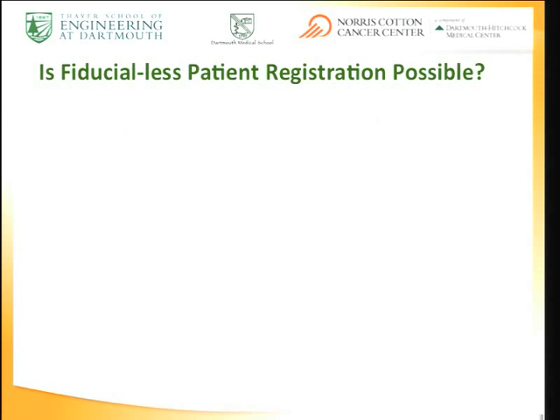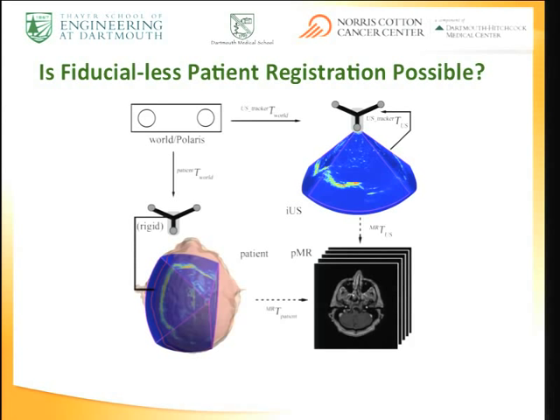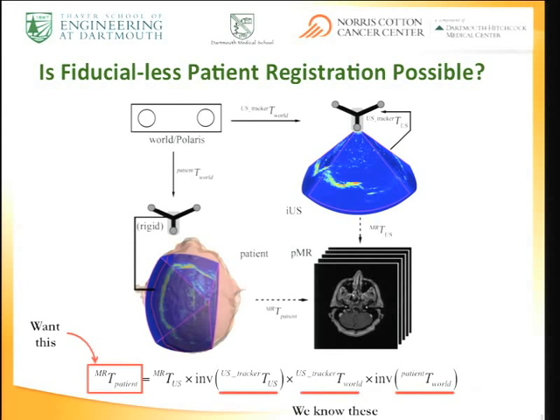So here's the picture, and here's the equation down here. This is what you want to get. You want to find this. You know these guys. This is the ultrasound to tracker transform. We've calibrated this in the lab going in. And this is the tracker system. We know what that is, produced by the vendor. So what you want to do is try to find this. If you could find that, then you could indeed do what David would like to do. He'd like to just walk in, patient's there, put his scan head down, be registered. That's his approach. So that is a challenging problem.